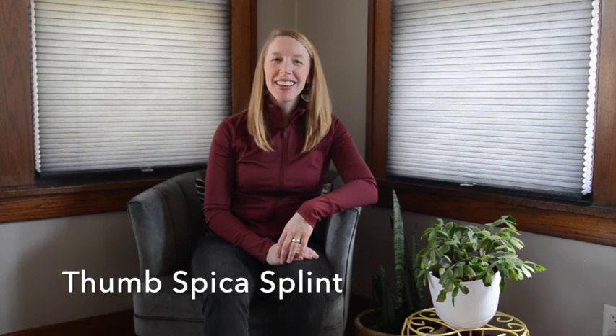Hello, my name is Vanessa and welcome to Ortho Refresh. This video will review how to place a thumb spica splint — that is a forearm-based thumb spica splint. This may be IP joint included and extend to the tip of the thumb, or it may be IP joint free and allow for motion at the distal phalanx.